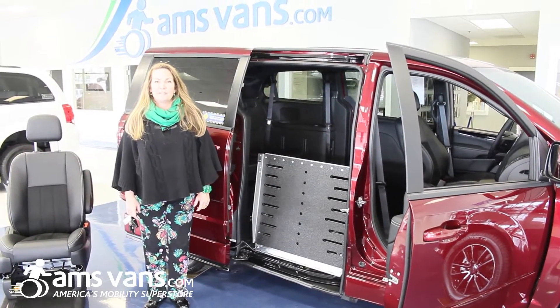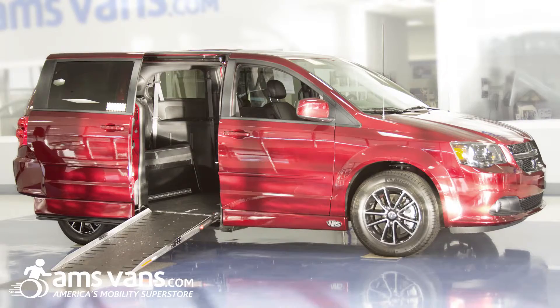Hi, my name is Ginger and I'm with AMS Vans. This is our Legend side entry conversion.